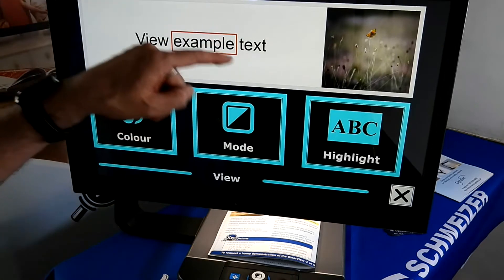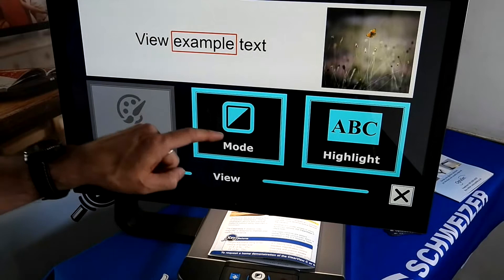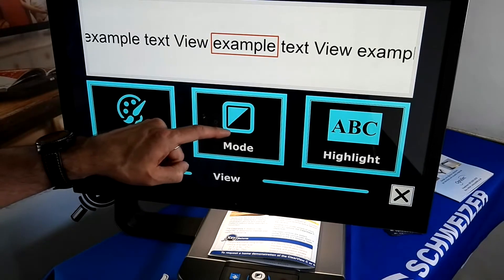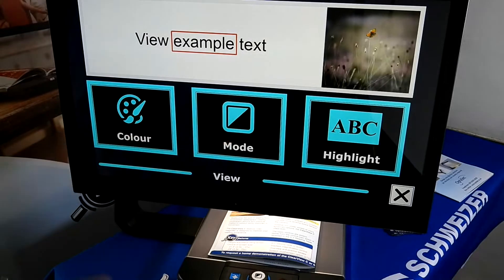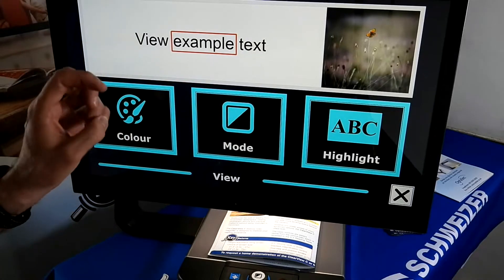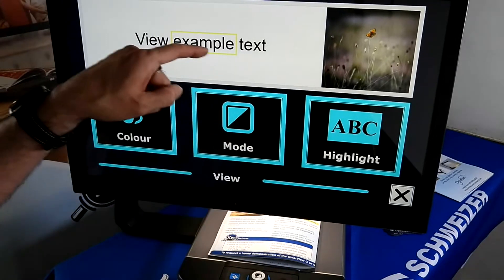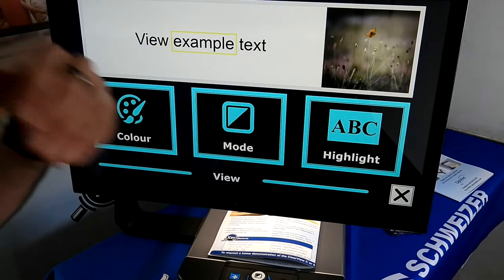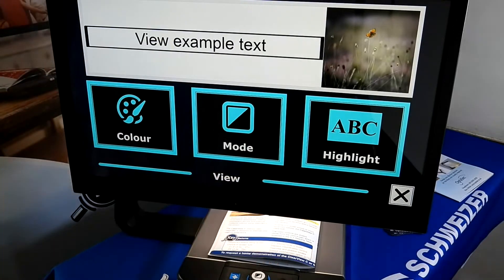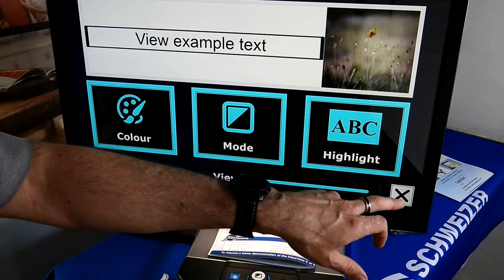The mode allows us to change the setup — Page, Column, or Line. You can also toggle high contrast on, and set different highlight styles such as highlight box yellow or highlight line, depending on the individual's preference. X always brings you out of that menu.